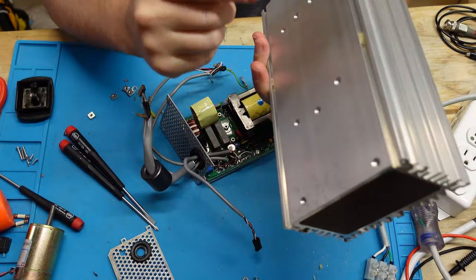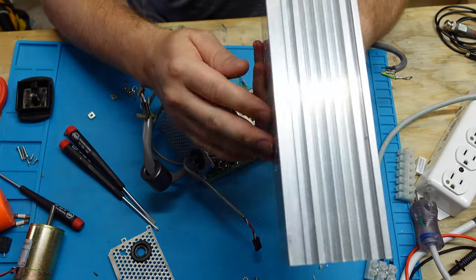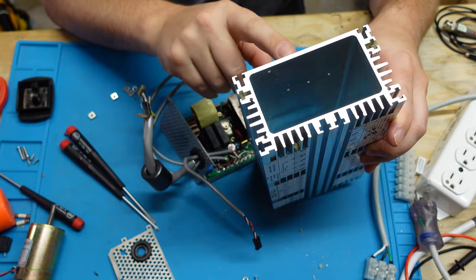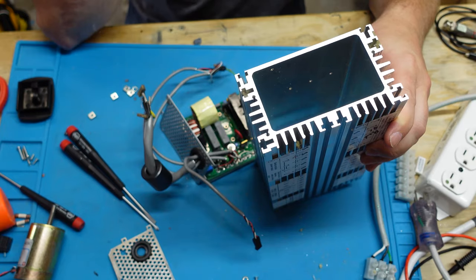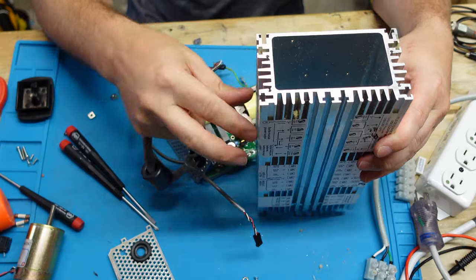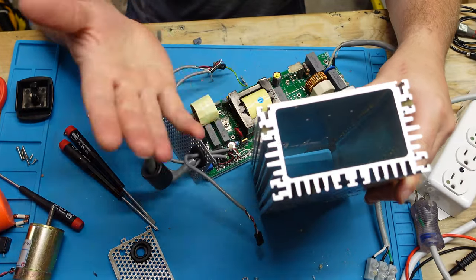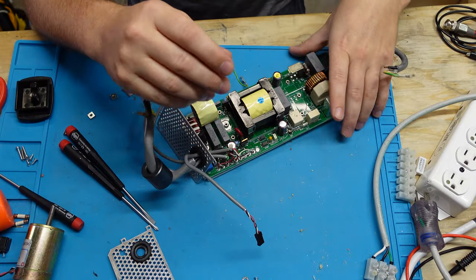And all the components that sink heat were mounted to the bottom, which makes no sense because there would be very little thermal transfer between the sides and the top and this base plate right here. You can see there's very little material which would allow it to transfer heat. So why would they do that? I don't know. It gives them a lot of mounting options, obviously, but as far as thermal performance, mounting stuff to the bottom doesn't really help it very much. But that's the heatsink anyway.